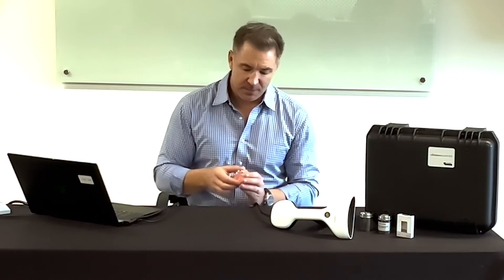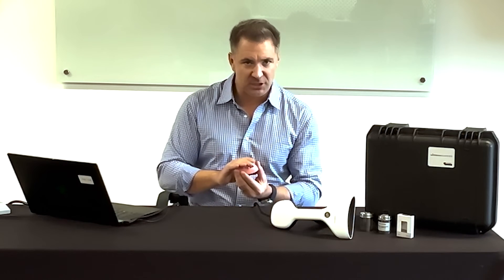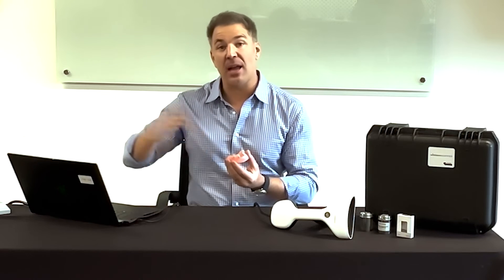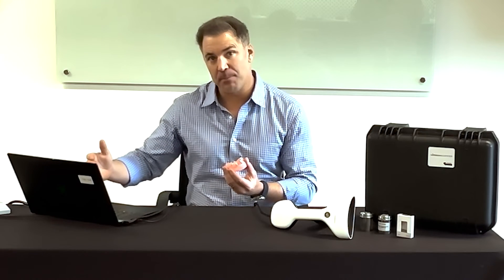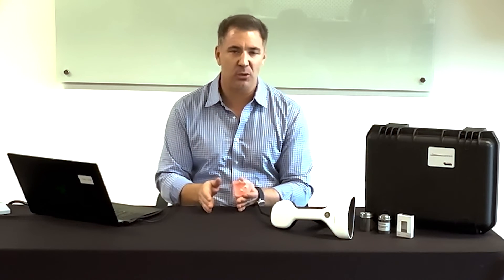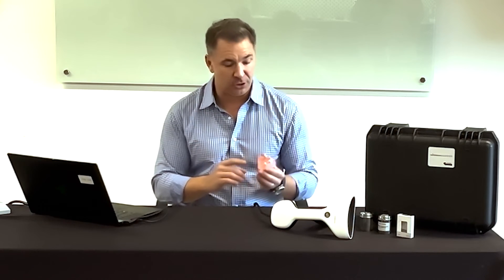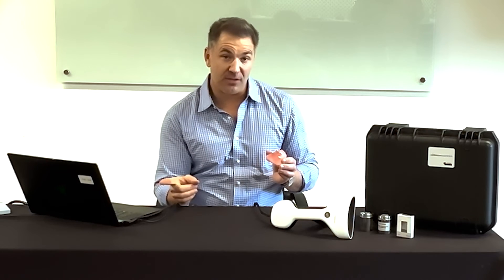Now let's talk about an application. The unique part about the Micron Mapper is that it gives you the ability to scan both the photogrammetry scan with these scan bodies and the soft tissue scan. For a day-of-surgery immediate provisional — 3D printed, position captured with the Micron Mapper, printed, and delivered all within the same day — we can significantly speed up that process with one unique feature: using these scan bodies for both the soft tissue scan and the photogrammetry scan.